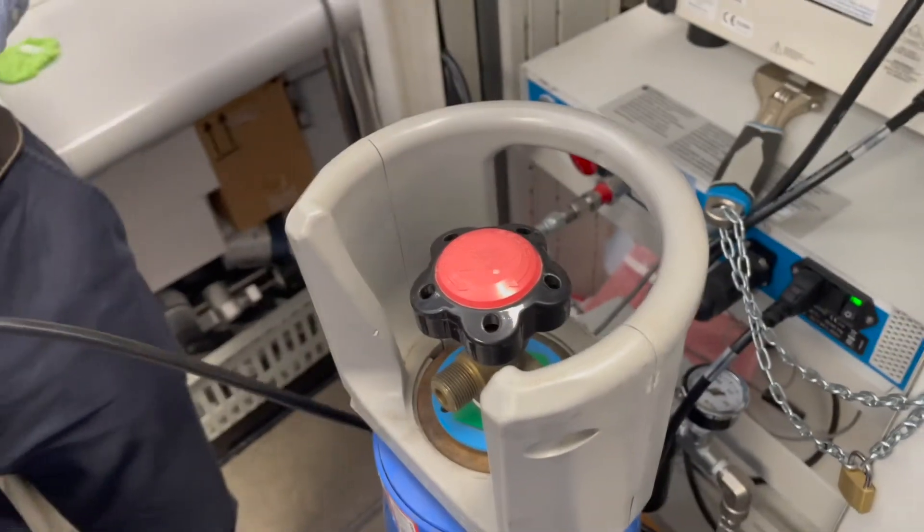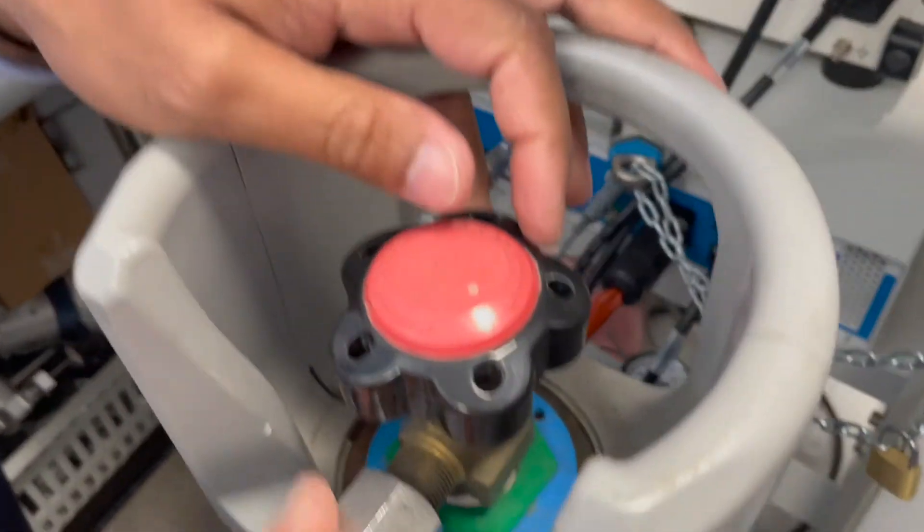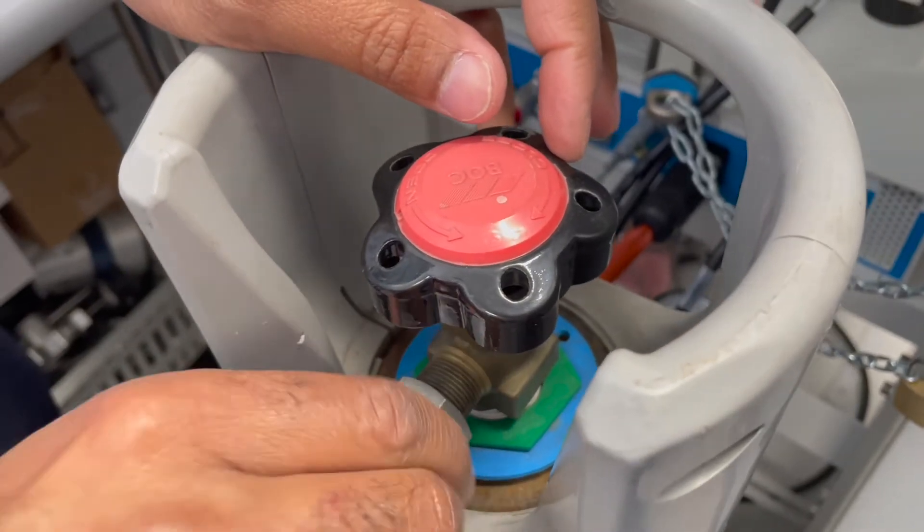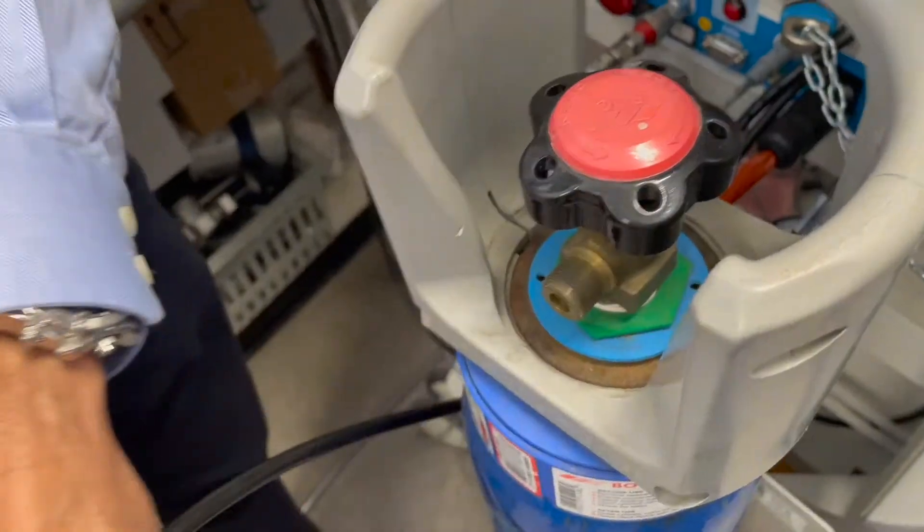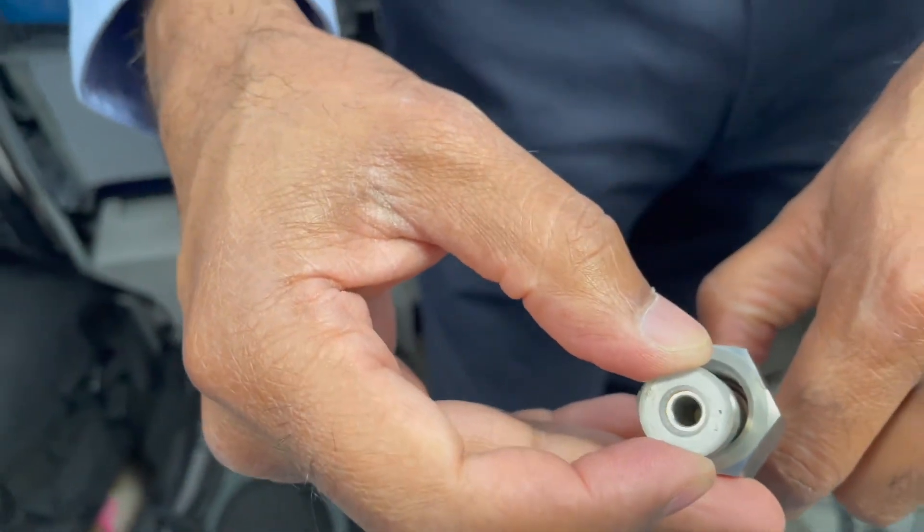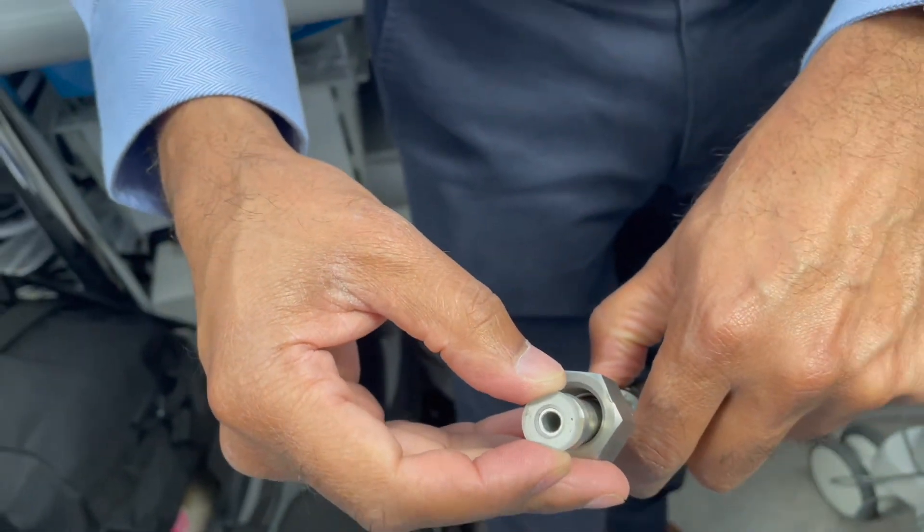Strictly speaking they say this can be hand tightened but to be honest with you all the ones I've tried to do to hand tighten they leak. There's a little washer, so if this washer isn't there that's when it normally leaks so when you're changing it just be careful because sometimes it can just fall out.